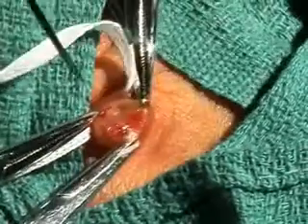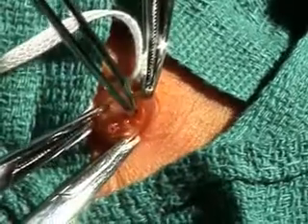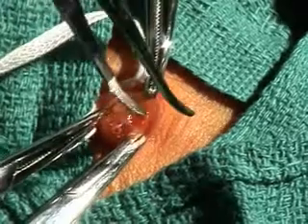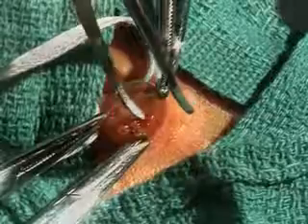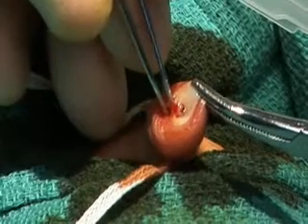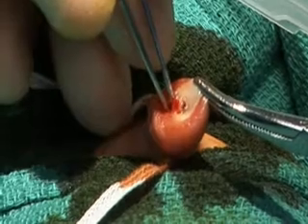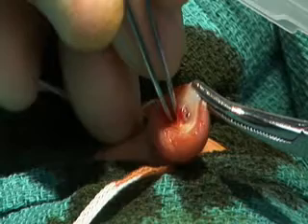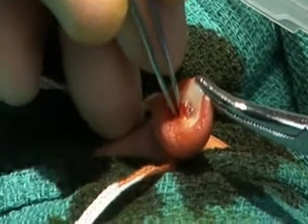Using your non-dominant hand, place the closed or pinched tip of the curved iris forceps into the lumen of the artery to a depth of approximately 0.5 centimeters. Keep the tip closed on initial insertion and then remove the forceps. To dilate the artery further, place the closed tip of the forceps back into the artery, insert to a depth of 1 centimeter, and allow the forceps to open slowly. Leave the forceps in an open position for 20 seconds to dilate the vessel completely.